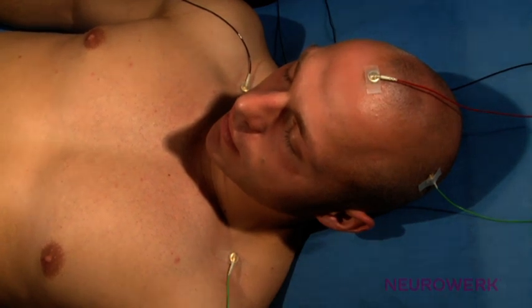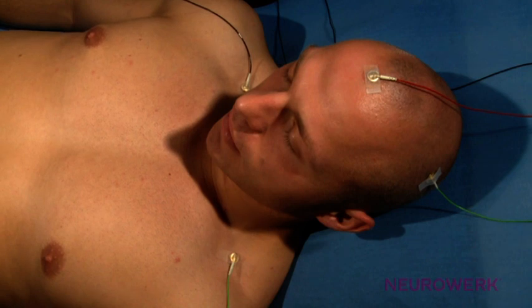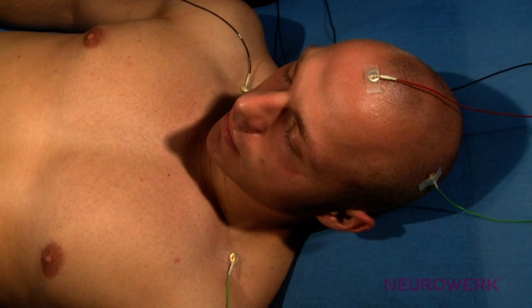The implementation of the somatosensory evoked potentials is basically similar for all nerves that are available for this examination. Therefore, it is recommended to first carry out the examination using the example of the median nerve. The techniques shown and described herein are essentially repeated in all other nerves, particularly when it comes to the basic application of the stimulation and recording electrodes.